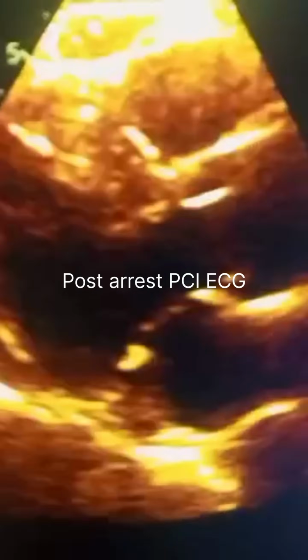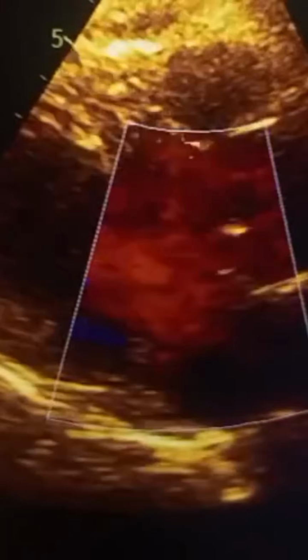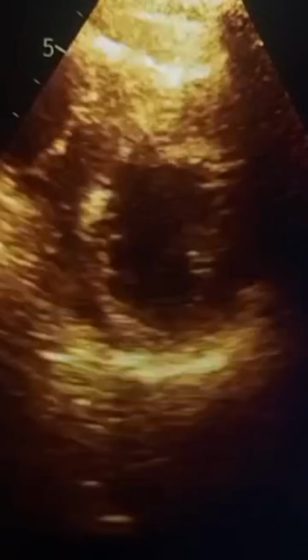So this is his echocardiogram, which is fine, and all segments are working. There is no significant wall motion abnormality. The dimensions are fine, and they seem to have recovered without any myocardial hypokinesia or loss of myocardium. So this was very reassuring. As you can see, this is short axis, and all segments are working. This was quite surprising to us, but in any case, it is good news that his LV was fully preserved.